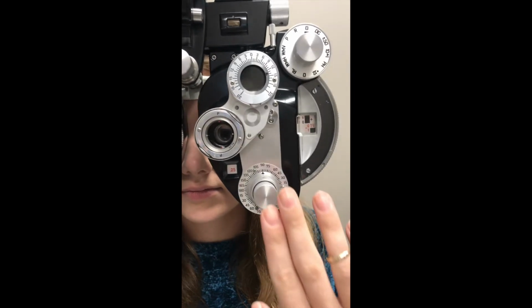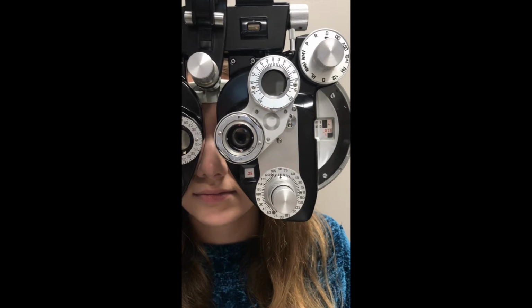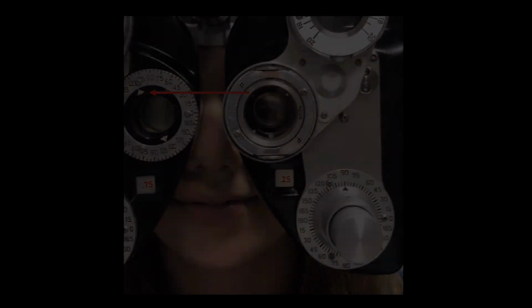We'll come back and pick up on power refinement mode and make sure that she has enough cylindrical power in there at step number 3. This step begins with asking the patient whether they prefer the red dot to the left or to the right.